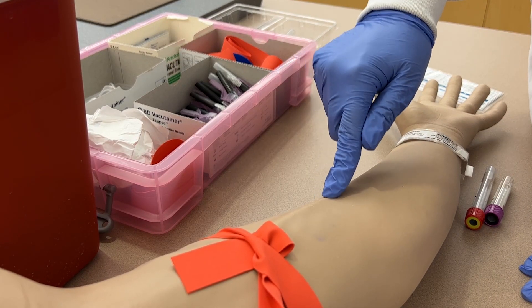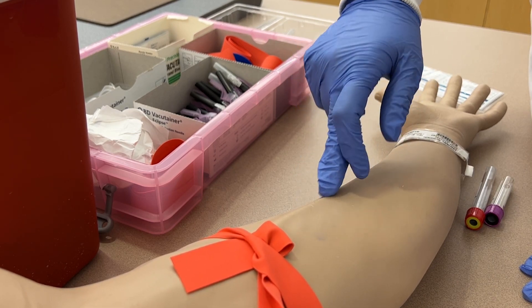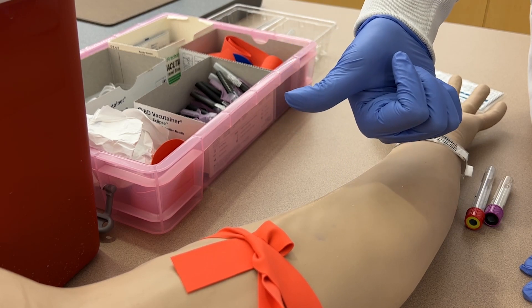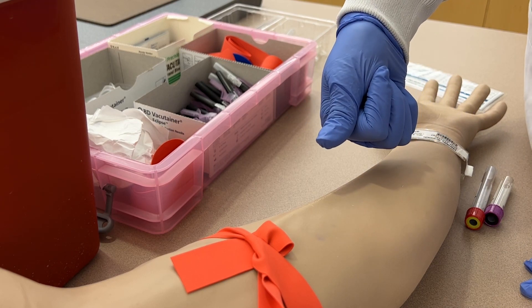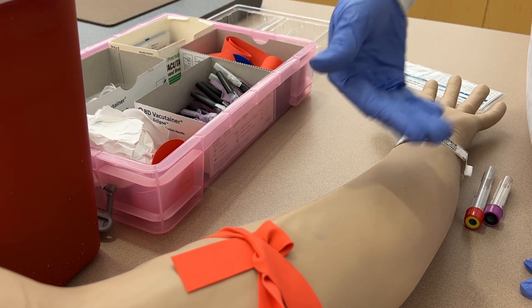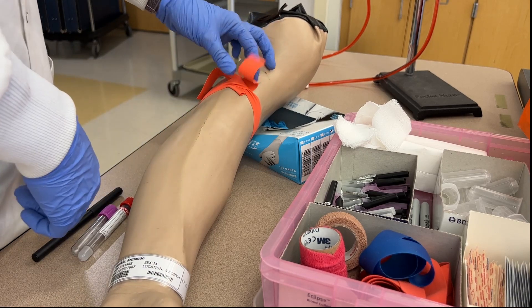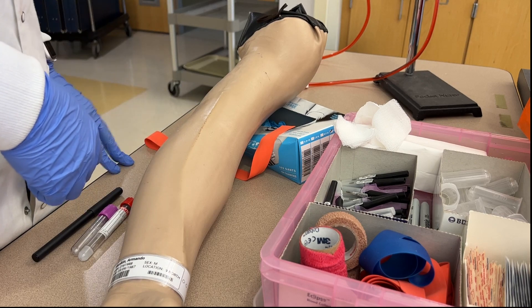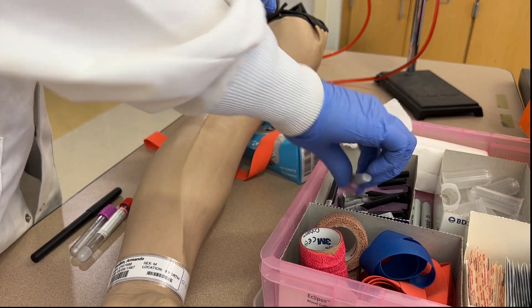Then you can palpate for the vein using your index finger or middle finger to track the depth and direction of the vein — it should feel spongy and bouncy. You don't want to palpate with your thumb because your thumb has a pulse and it would be difficult to tell apart your pulse from the patient's pulse, and we don't want to stick a needle into anything with a pulse because that would mean it's an artery. Once we've tracked the depth and direction of the vein we can release the tourniquet so we don't hemoconcentrate the patient's blood, then assemble our supplies.